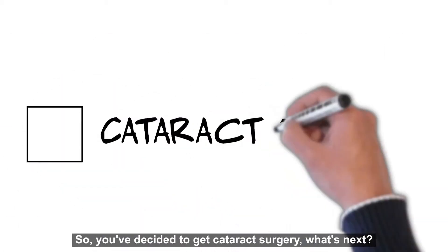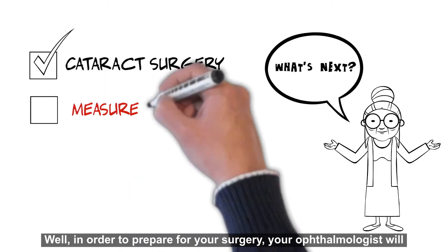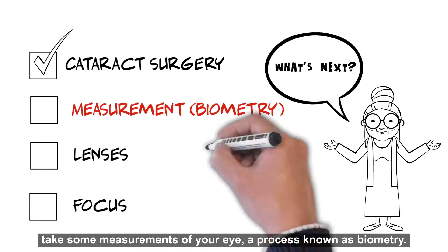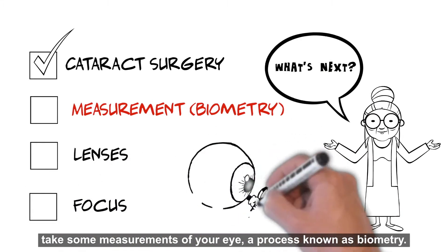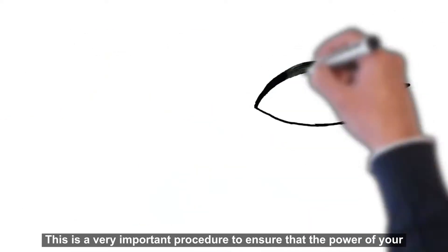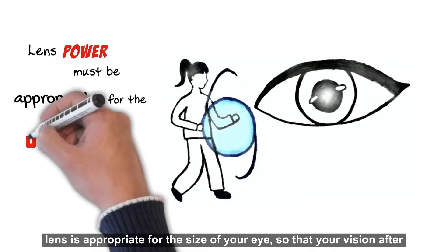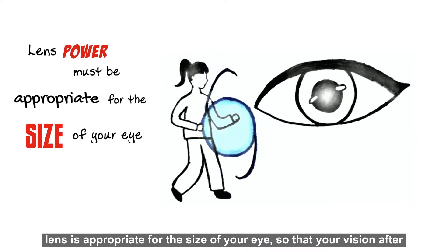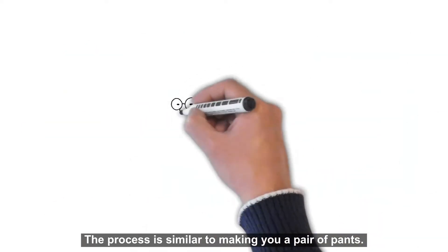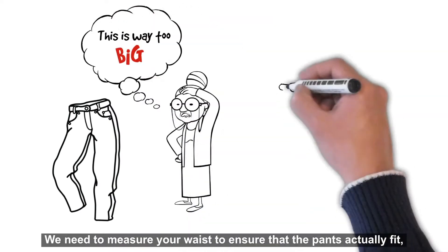So you've decided to get cataract surgery — what's next? In order to prepare for your surgery, your ophthalmologist will take some measurements of your eye, a process known as biometry. This is a very important procedure to ensure that the power of your lens is appropriate for the size of your eye, so that your vision after surgery is as clear as it can be. The process is similar to making you a pair of pants — we need to measure your waist to ensure that the pants actually fit, not too tight or too loose.